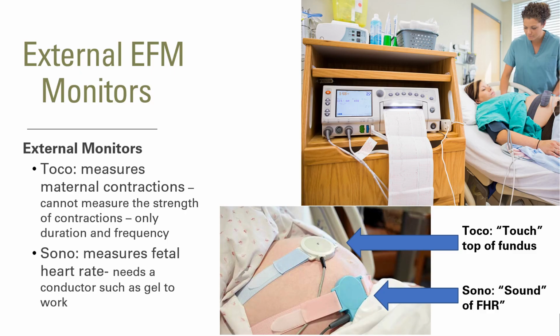The more famous one, you will have an opportunity to help assist in placing, is the external electronic fetal monitor. The external monitors include two components. One is the TOCO. TOCO for touch. You're going to put the TOCO on the top of the fundus, and this connects to the electronic fetal monitor.